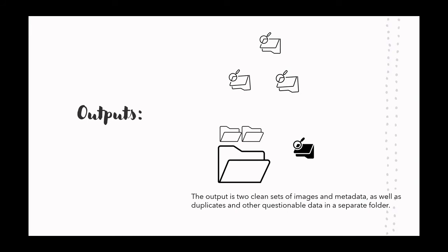Somebody just accidentally copied the DICOM file for one of the images 50 times. You would not want to feed that into your training data or test data. So you'd want to get rid of them. And there are other important points about how to clean data.